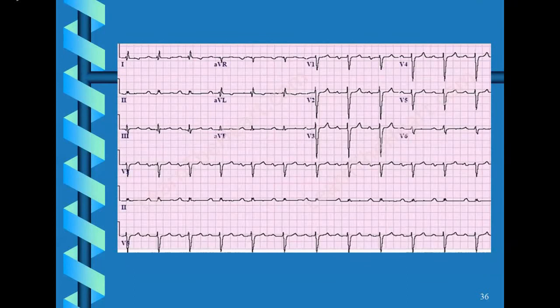Another ECG. So it's a 12 lead ECG with V5 as a rhythm strip. Okay. And I cannot comment on the standardization because it's not written here. Usually it is written here or somewhere on the paper: the paper speed and the millivolts. But as you can see clearly, even if you don't have the numbers, this is the standard box, as we discussed, which shows the voltage, okay? So the voltage seems to be fine.